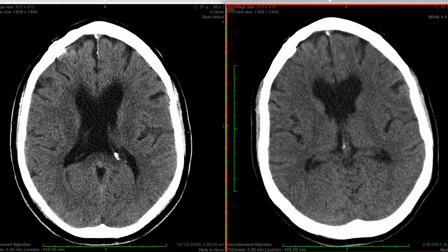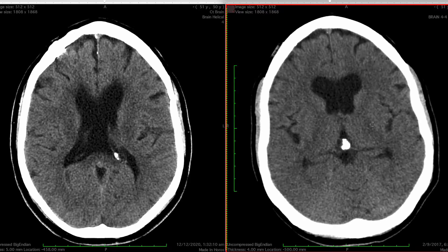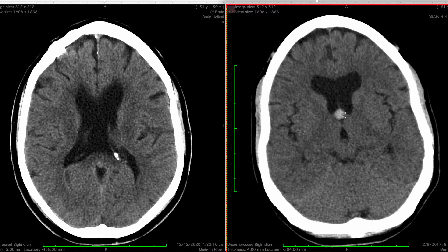On the screen we have two CT brain scans: one done when the patient was 47 years old, and the second on the left done when the patient was 50 years old, three years later. Starting on the earlier scan, we can immediately see that in the center of the screen there is a unilocular, high-density, well-circumscribed ovoid lesion in the foramen of Monroe. This is pathognomonic of a colloid cyst of the third ventricle.